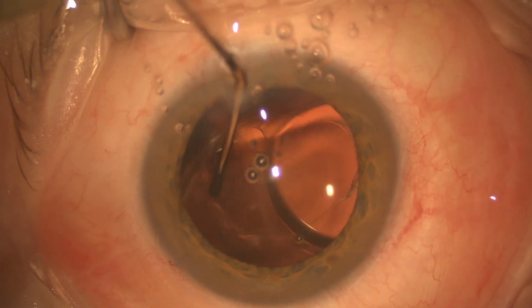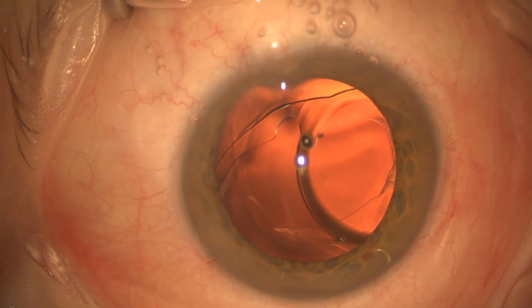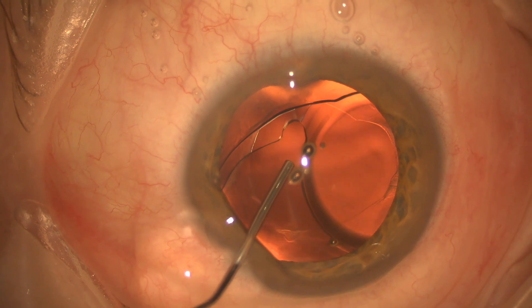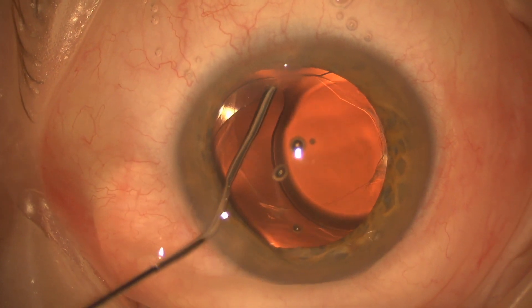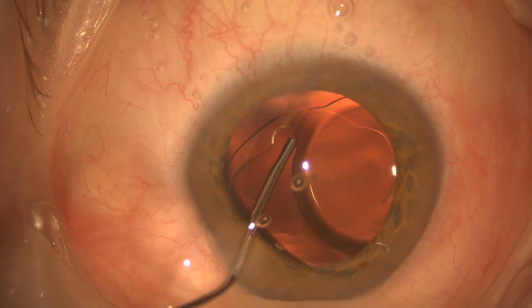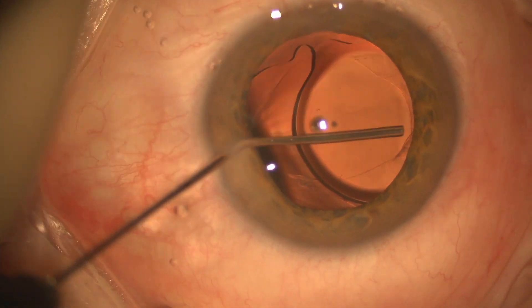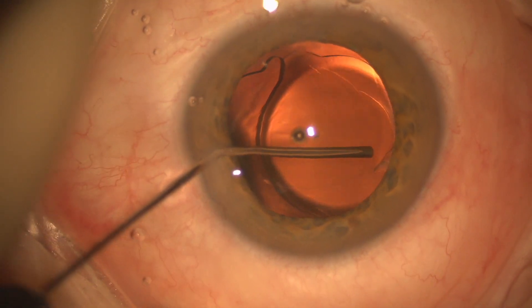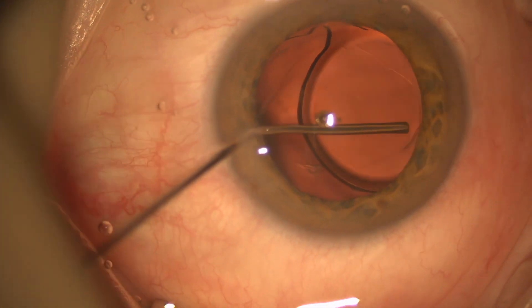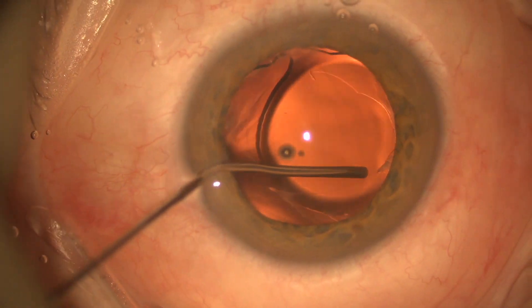That's really key for recentering this because the lens has got to go into that bag, and we would have had to probably exchange the IOL if we weren't able to break up that adhesion between the anterior capsule and the posterior capsule. Here we've basically got the lens free from the bag, so we're just using the viscoelastic cannula to push on the haptic-optic junction and to try to rotate the lens around just to see the other haptic.